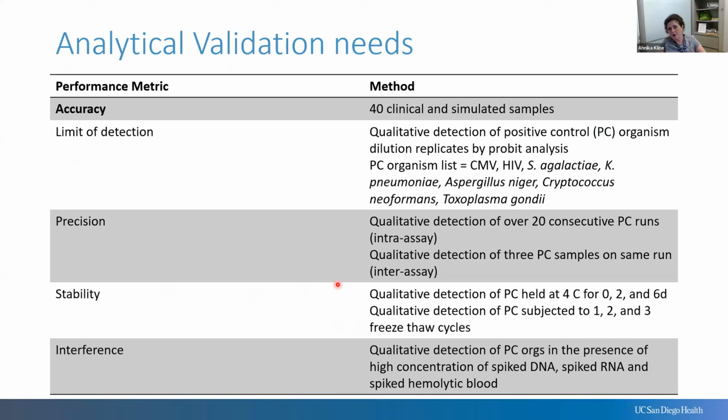What's needed even to bring this assay online is a lot more. So we're working currently on accuracy with clinical and simulated specimen samples. That's been really the focus, and continues to be the focus, of what the Prepare Award was for: the flow cells, to optimize and see how accurate we can get it. But in order to bring an assay online to the lab, we need LOD studies.